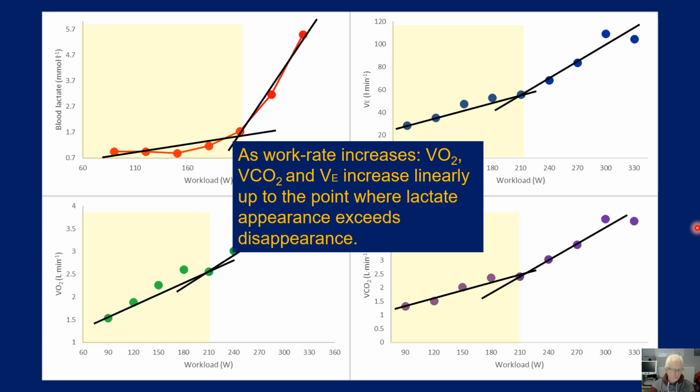To make our work a little easier to understand, I've put these lines on to help us. It's pure chance that this data point is lower than the others. It's not a common occurrence that it's suddenly lower; it's just the way the data collection has gone. I don't want to focus on the VO2 graph, but on these graphs here. Look at the CO2.